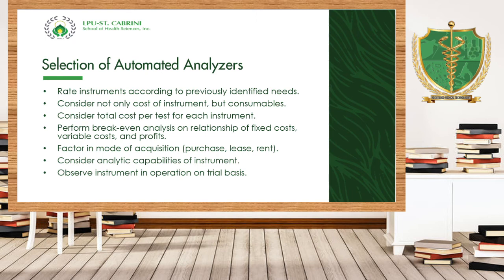Kaya yung doon mo tatanong, aside from how much the machine cost, ang sunod mong tanong alin? Yung kanyang consumables. Kasi yung machine, one time, big time. Isang beses mo lang siyang bibilihin. Hindi mo naman siya bibilhin every day, every month. Hindi ka naman papalit ng machine every day. No, yung mga control mo, yung mga tips mo, yung mga ginagamit mo sa iyong machine, yun yung binibili mo almost every day. Yun yung pinapalitan mo almost every day. And if this costs you too much, then it is not recommended na yun yung bilhin mong machine.